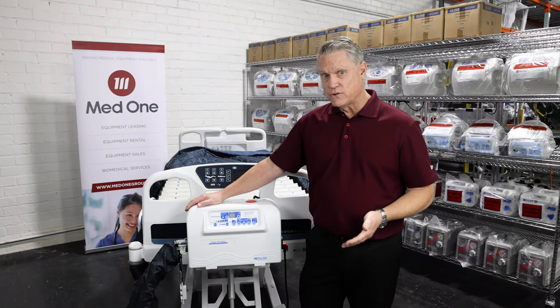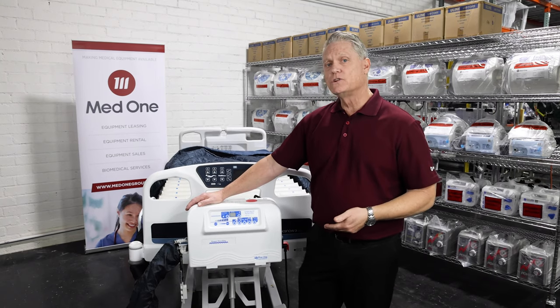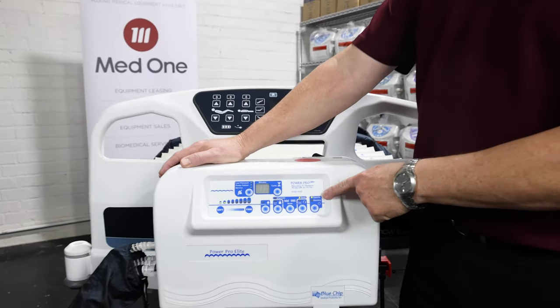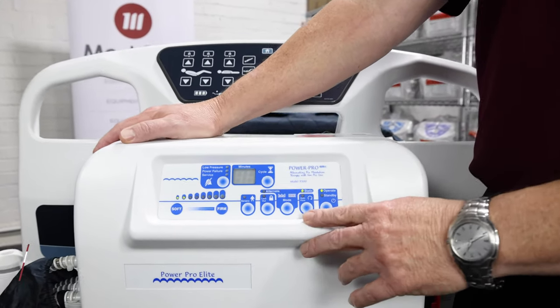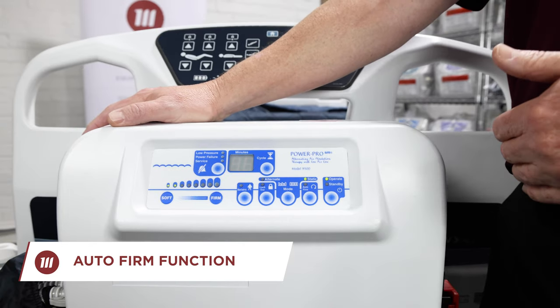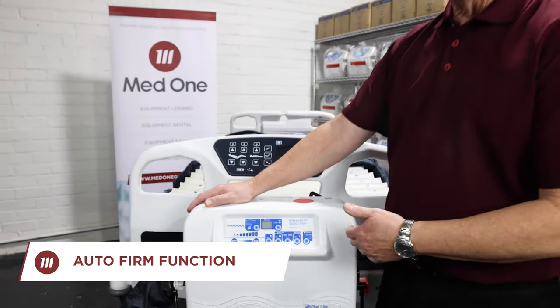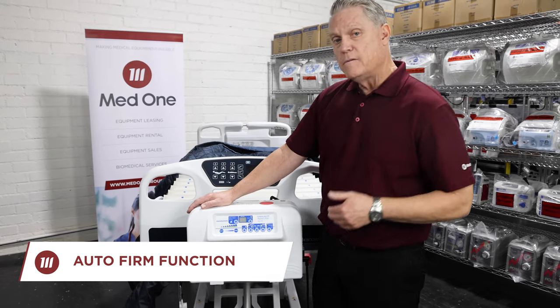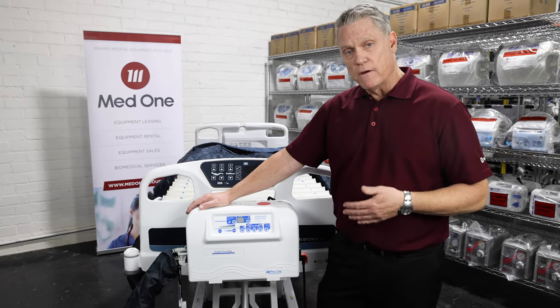Now that we've connected the mattress to the control unit, let's take a closer look at the keypad. With the mattress already on in operate mode, the next key over is our auto firm. Auto firm is used for patient repositioning. To engage this feature, simply push the button and the light will come on. In about 10 or 15 seconds, this will become a very firm mattress.